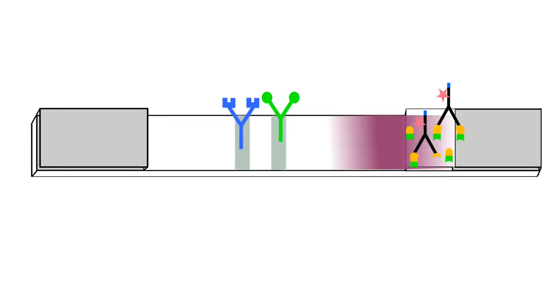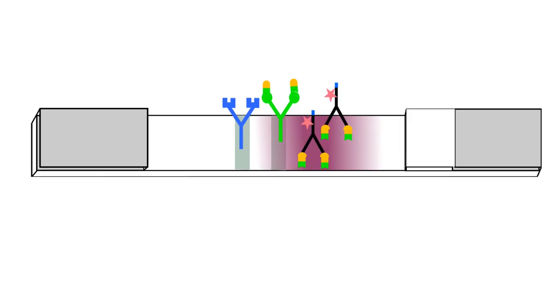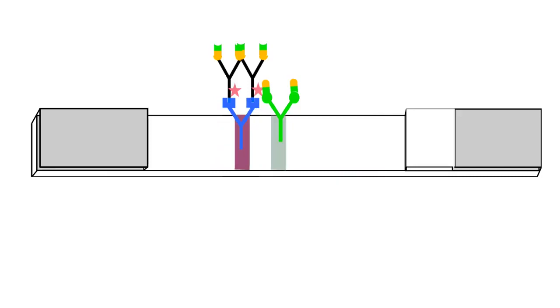Now, as migration starts, free antigens will migrate faster than the antibody-antigen complexes. This leads to an absorption of the test line by the free antigen. Since the free antigen is not coupled to the conjugate, hence there is no color, the test line will remain clear, while the antibody-antigen complexes will continue to migrate, and whether they bound an antigen or not, they will bind to the control line and color the control line purple. This means that we have a false negative result in a case where we have a very high dose of antigens. This is, of course, a very dangerous effect, as you will miss high infections.